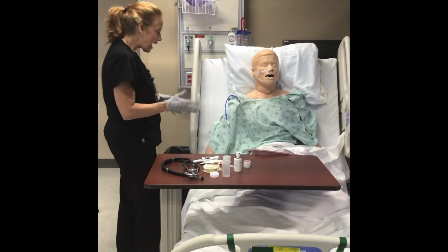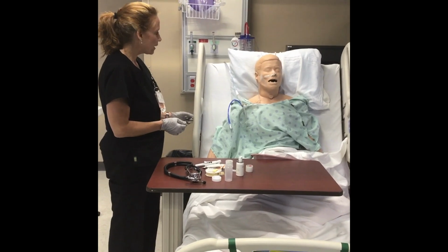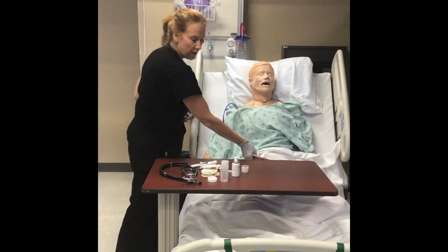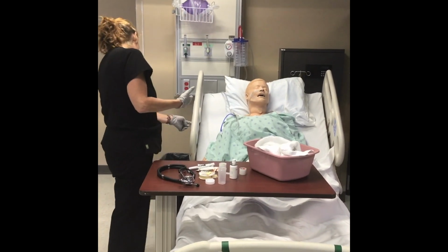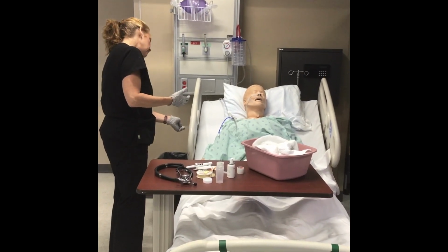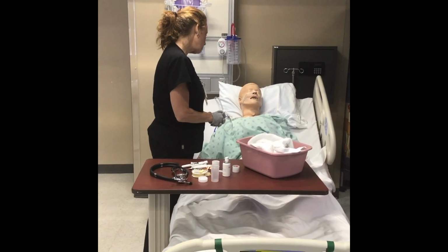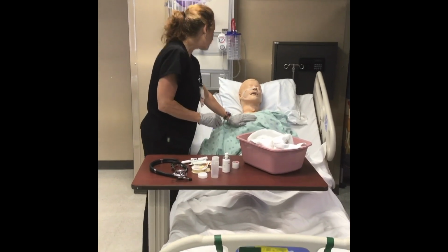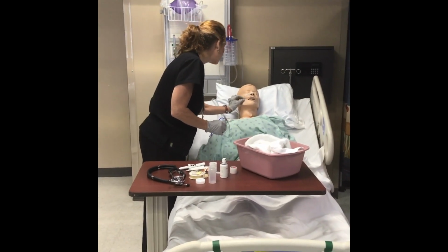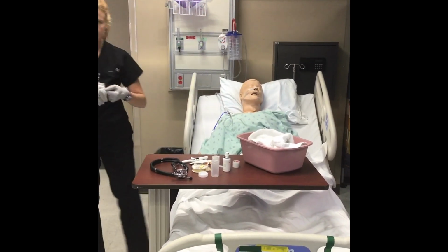Okay? Now the last thing that I need to do is to lower your bed. Now we have to lower the bed to only 30 degrees to prevent aspiration. And so if your family comes in and they want to lower your bed for any reason, you need to let them know that you have to stay at this 30-degree angle. Do you have any questions for me? No. Okay, well, thank you for allowing me to take care of you, and I'll come in and check on you in a little bit, okay? Okay, thank you so much. Thank you.